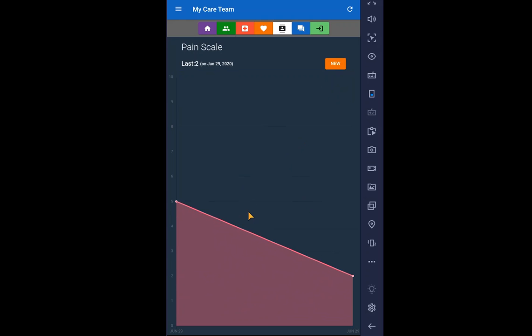And all this information is available to you as the clinician, and you'll be able to see this information that it's coming into you, and you'll be able to act and react on it. You'll be able to send out messages, text messages. You'll be able to send out phone calls. You'll be able to alert individuals. So if a patient does have a sudden drop in blood pressure, or blood pressure that you feel is out of what is expected for the medication, then it will send out immediate notifications and messages to any particular group of individuals, or an individual. Could be a family member, could be the primary care provider.